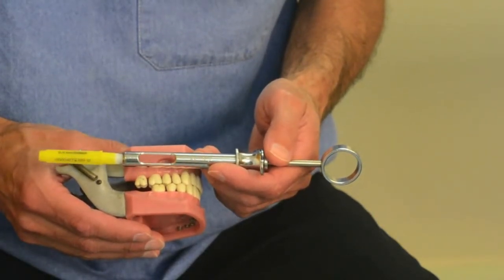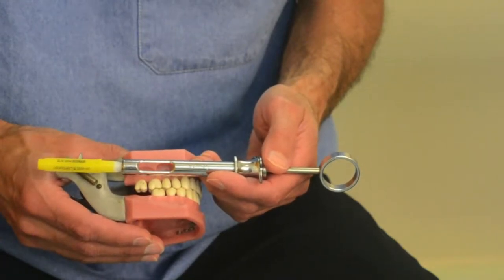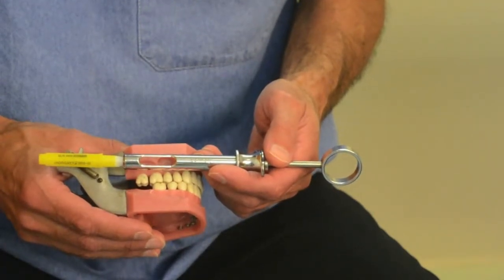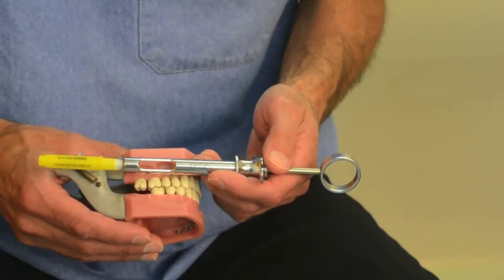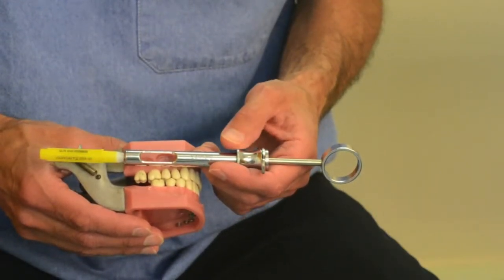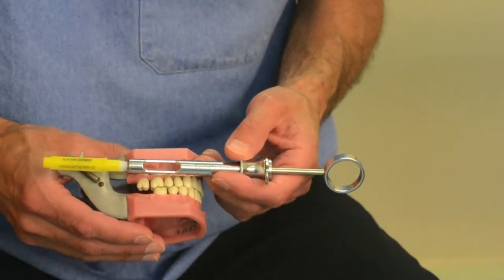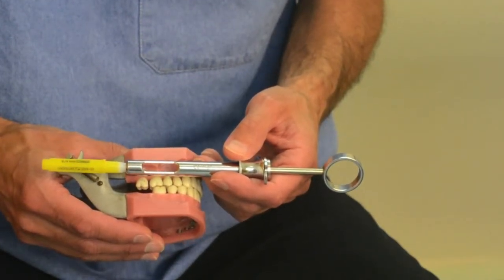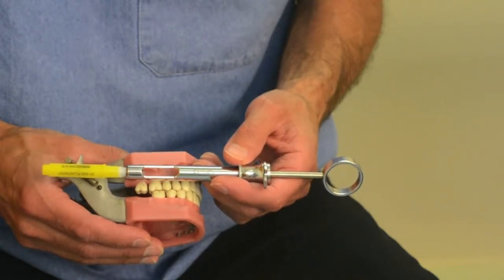After the needle is in position, you aspirate and check for bloody aspirate, and if it's negative, you can proceed to inject very, very slowly. Similar to the standard inferior alveolar block injection, this approximates the opening level of the mandibular canal and deposits local anesthetic in that vicinity.